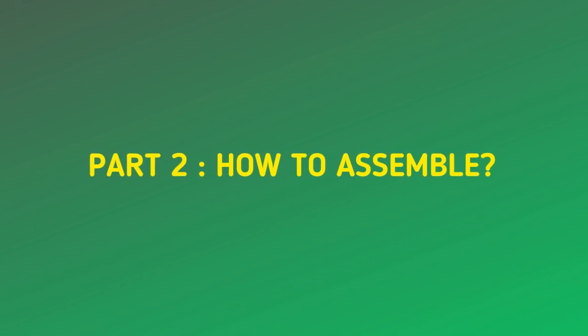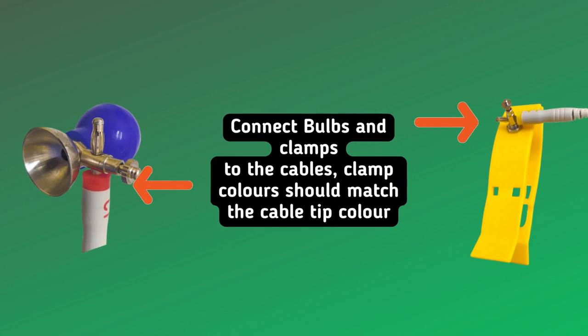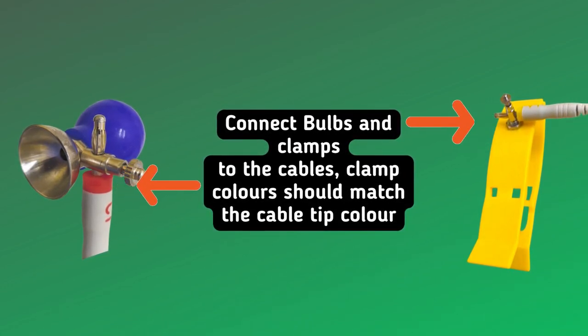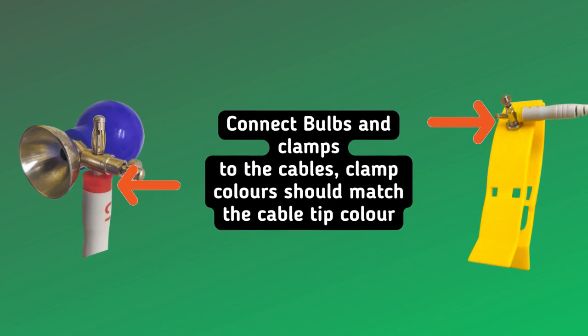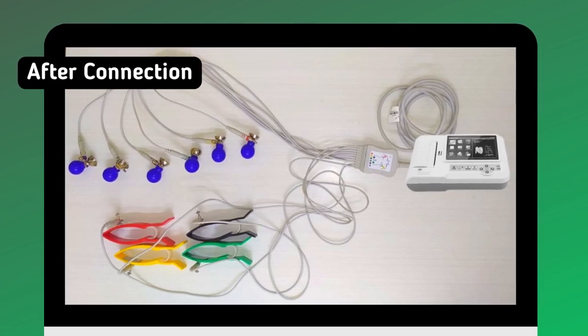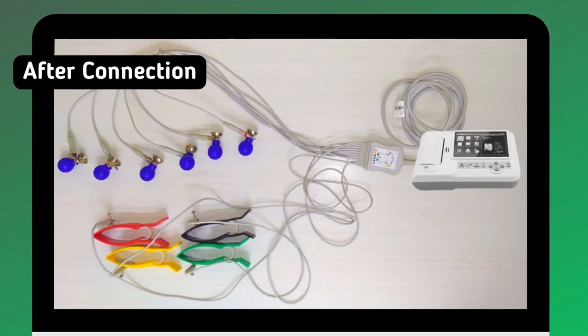Part 2: How to assemble. Connect bulbs and clamps to the cables. Clamp colors should match the cable tip color. Finally it will look like this.